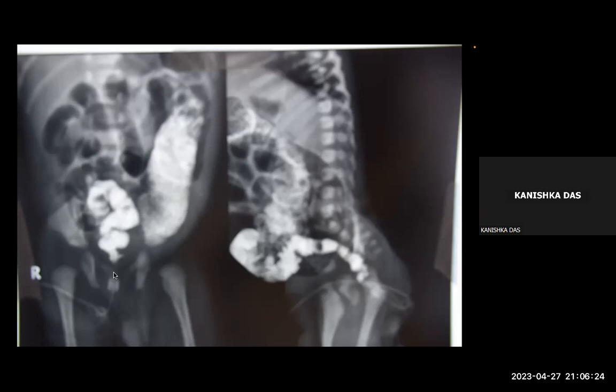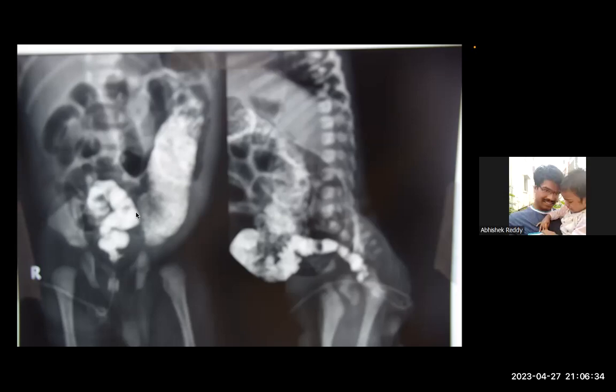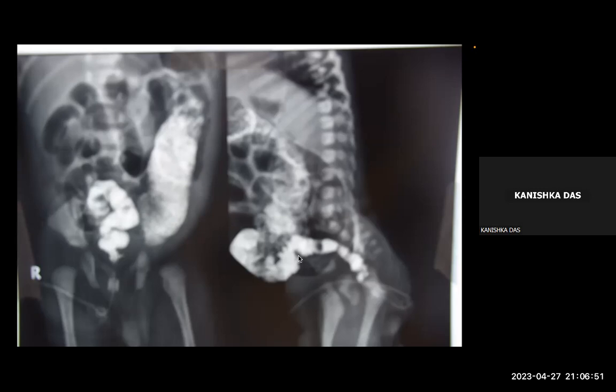Same way here. You talked about the recto-sigmoid ratio. You are saying that yes, it is reversed. This seems to be larger than the rectum. Go ahead. Then? So then there is a transition zone between the rectum and the sigmoid, recto-sigmoid junction at the descending colon. Yeah, rather than being here, it's somewhere here. So it's probably somewhere in the upper sigmoid descending that you have the transition zone. Because it is still narrow, and somewhere there it becomes large.